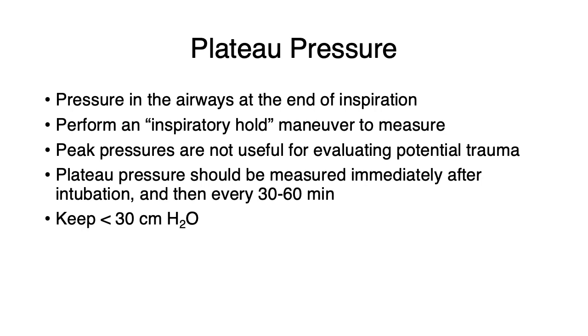You have to learn how to perform an inspiratory hold maneuver on the vent. And the plateau pressure should be measured immediately after intubation and then every 30 to 60 minutes to make sure that your strategy is protecting the lungs and doing all the things that you want to do. We want that plateau pressure less than 30 to prevent the kind of damage that we're concerned about.